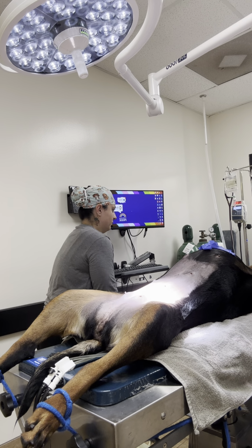Yeah, it seems very steady. So our blood pressure, our map is a little high, but really those numbers are pretty good, honestly. So I'm not overly concerned about that. 130, 80, 70, but I think that feels good to me.